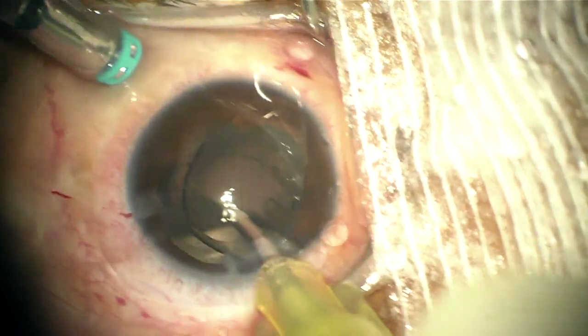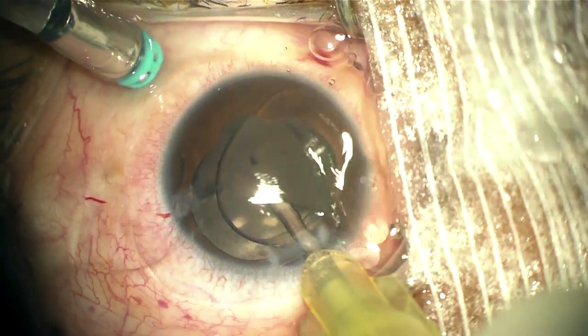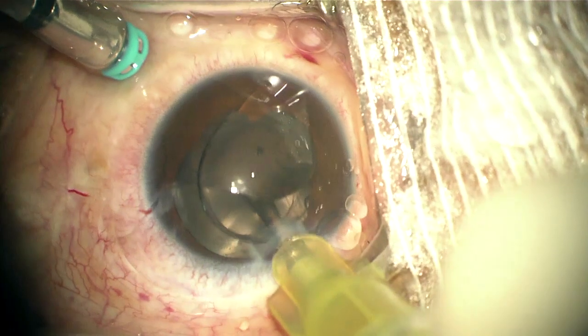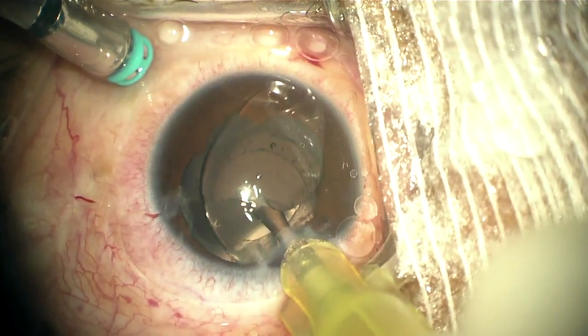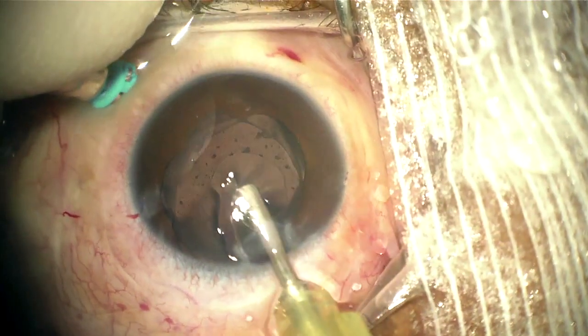Cataract surgery was done and posterior capsulotomy was performed with the forceps. Here I'm using the silicone oil extractor on a 20-gauge cannula through the main corneal wound and through the capsulorhexis, which makes the oil removal very efficient.